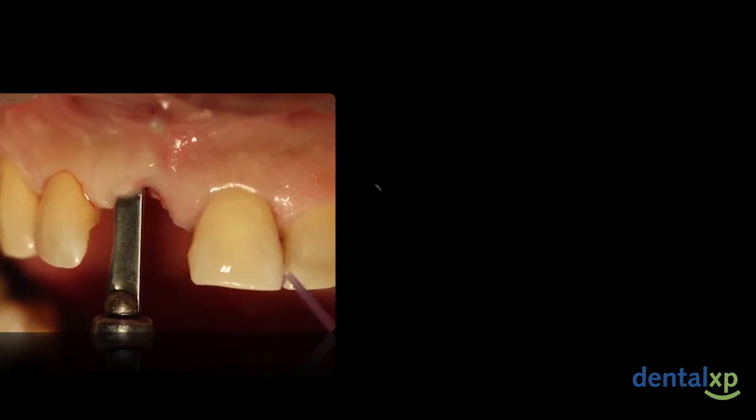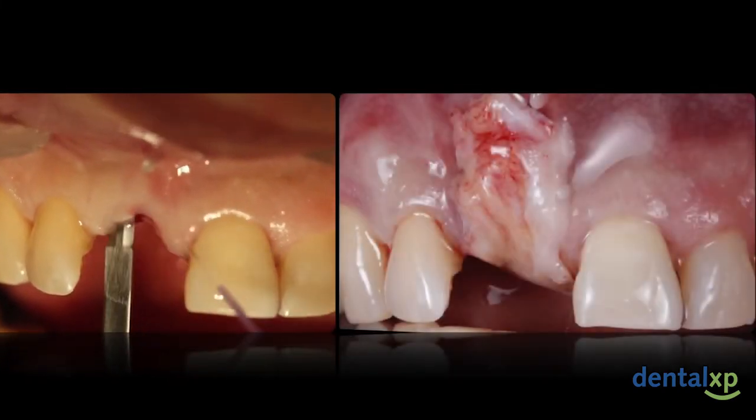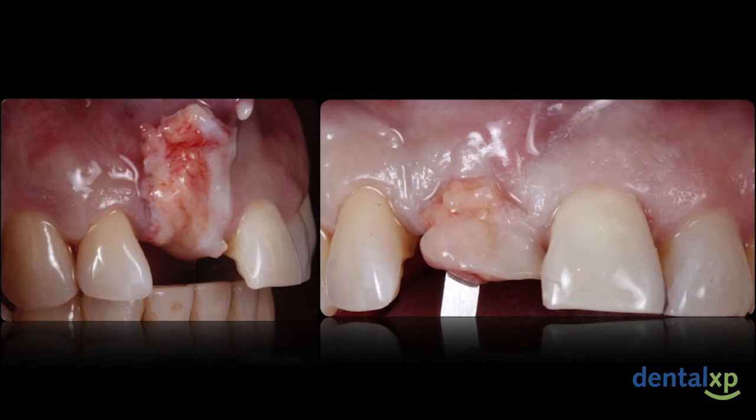Following which, we continued with a split thickness or supraperiosteal tunnel on the facial aspect of the site. And you can see we try not to involve the papillae in this area. If we can minimize the amount of disruption to the architecture we have, the better. And a connective tissue graft was harvested from this right palate in this case and introduced into this tunnel. One of the issues we may have with connective tissue harvested from the palate is obtaining a graft with a high adipose content. This may render the graft less stable and more prone to shrinkage over the long run.